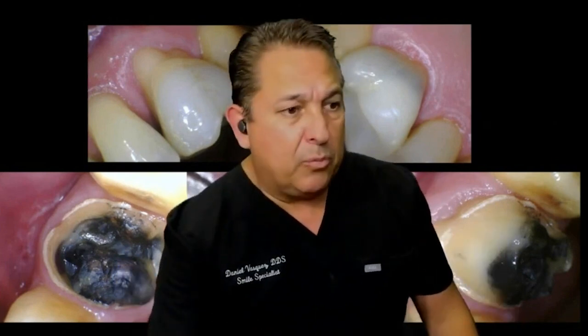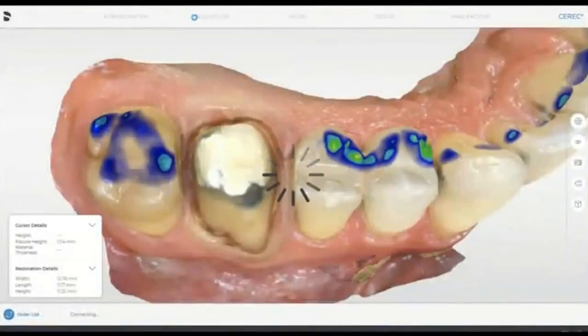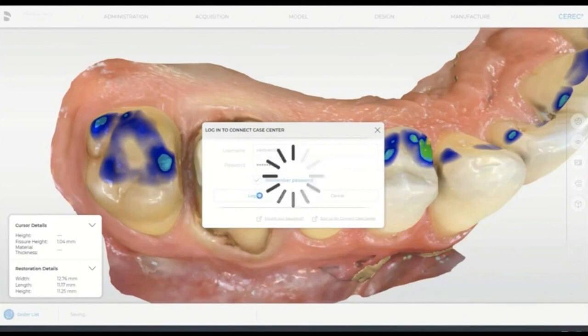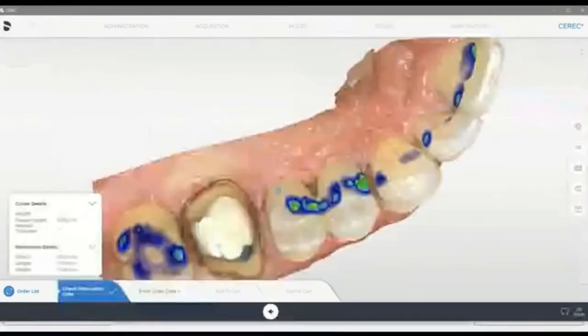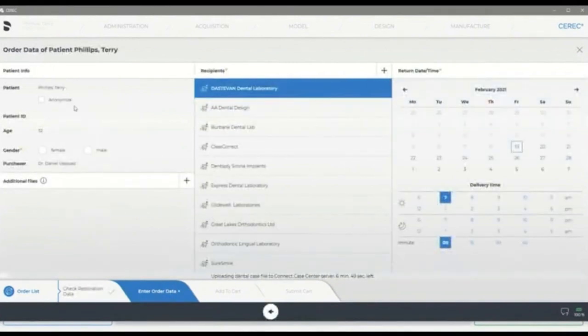So let me remove myself from the screen. So now we modify the prep, and here you go. Okay? We already took the impression. Right now, what I'm doing is sending this case to the lab. We use portals. They're safe, HIPAA compliant portals. In this case, we're using the Connect software in order to send it to the lab. Now, yes, I'll be sending this to myself, but I'm going to use this portal.